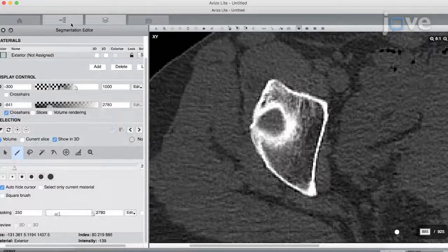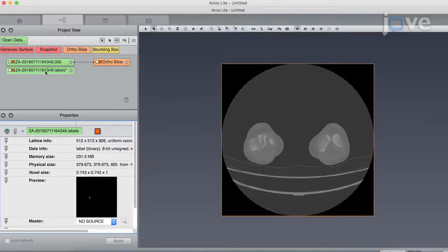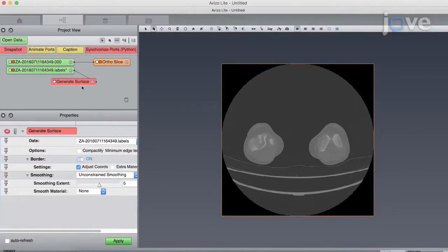To generate the surface data from the labeled bone cortex position data, click Generate Surface and use the slider to smooth the extent. Then click Apply.